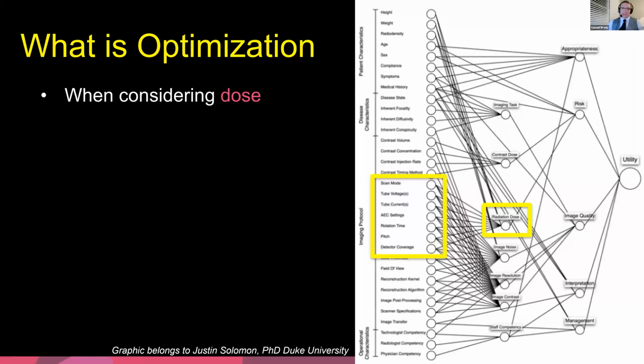Yes, and now that I think about it, up to this point everything is the same for the brain. I focused a lot on the brain because we do a lot more brain than face. But when you're doing soft tissue face, you're looking at sinuses, and then you've got your inner ear. Inner ears, obviously, you need good spatial resolution, so you need a good field of view, so that you can really see the tiny detail of the bone in the inner ear.